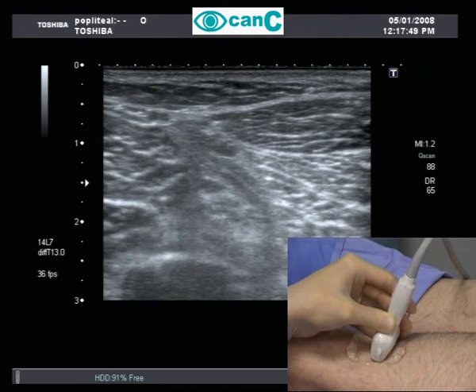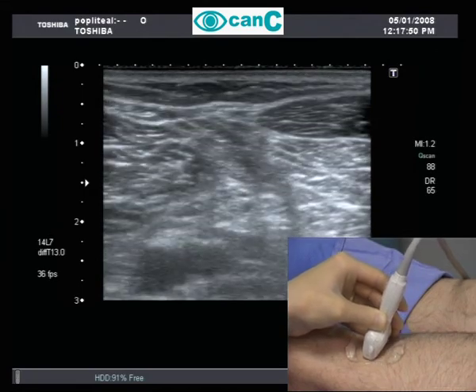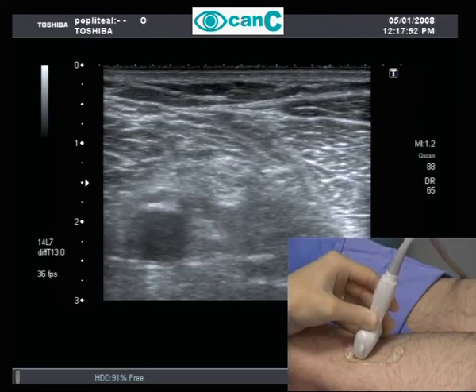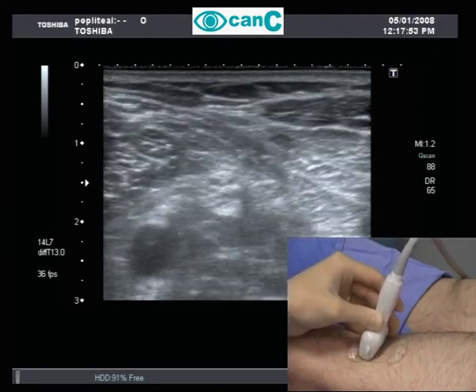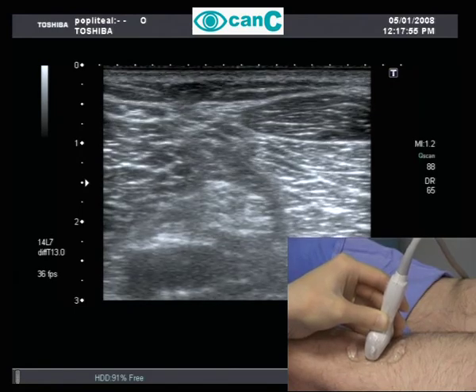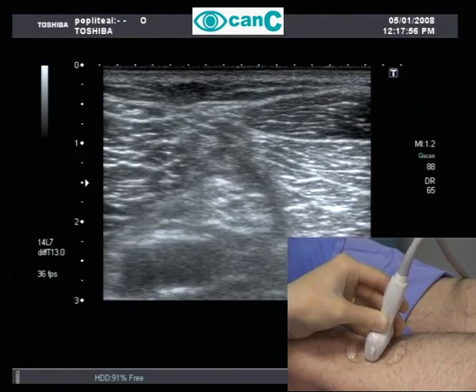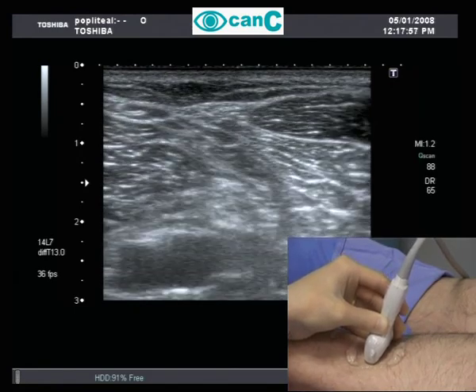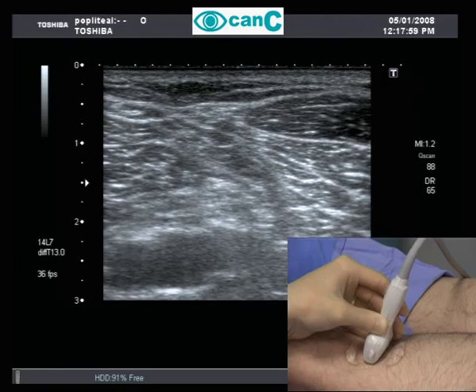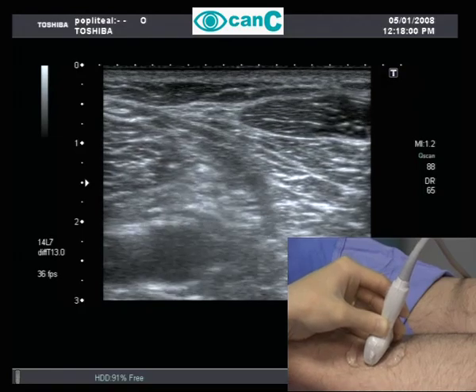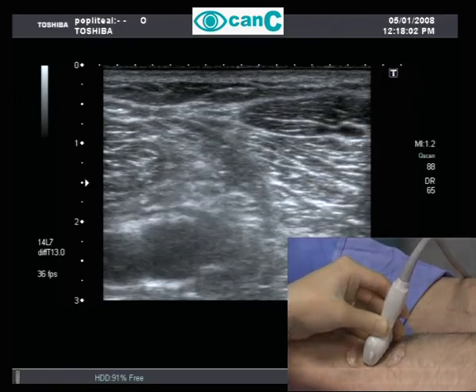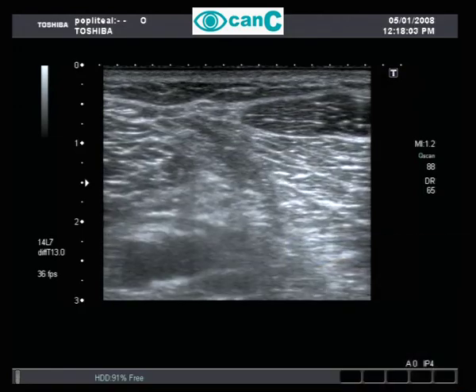Moving the probe along the course of the nerve demonstrates the point where the sciatic nerve splits into the tibial and common peroneal components. Passive extension and flexion of the foot demonstrates how the two components of the nerve move against each other.